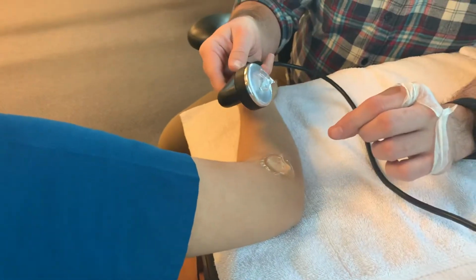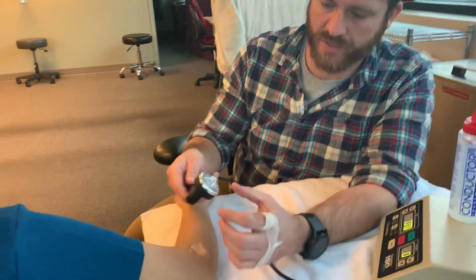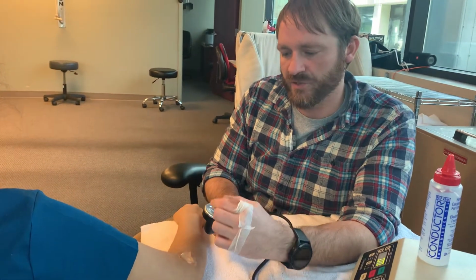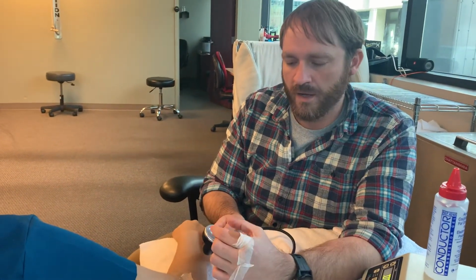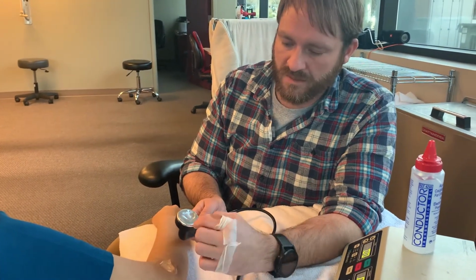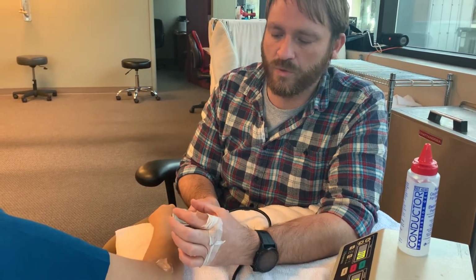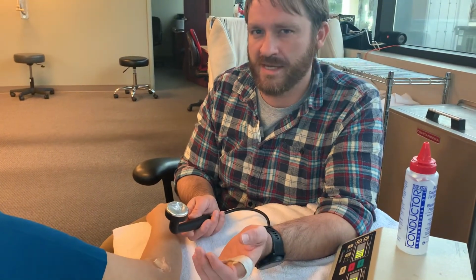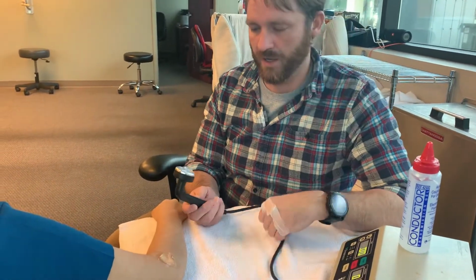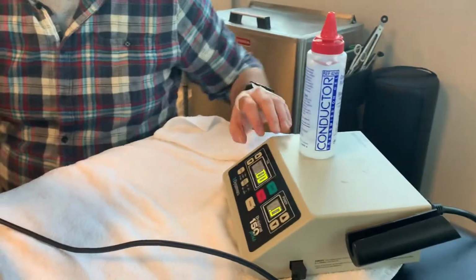And when we are determining the area, or how big of an area we want to treat, the research shows anywhere between 2 and 4 times the size of the effective radiating area. To be safe, usually if the area that you're treating is two times the size, that's about where you're going to want to keep it. So you make sure you get all of the benefits possible for the ultrasound. So again, I'm going to place that on the area to be treated.